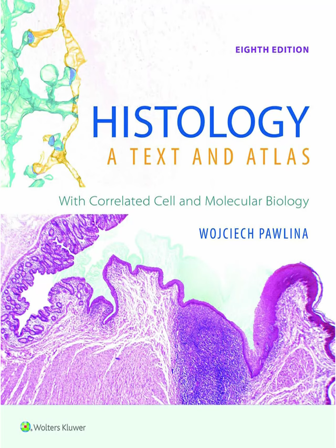And how does the visualization work, directly tagging the main antibody? That's one way, called the direct method, but more common is the indirect method. Indirect. Yeah, you use an unlabeled primary antibody that binds to your target antigen. Then you come in with a secondary antibody that's tagged, say, with fluorescence, and is designed to bind specifically to the primary antibody. Why the extra step? It amplifies the signal. Several secondary antibodies can bind to each primary antibody, making the target much brighter and easier to see. It increases sensitivity. Ah, clever amplification.